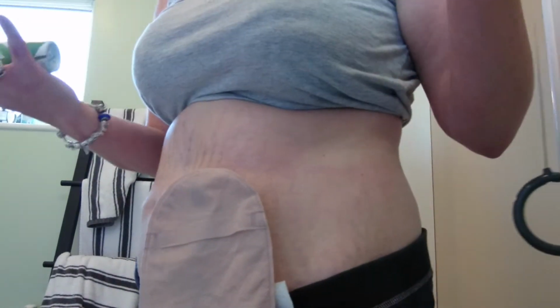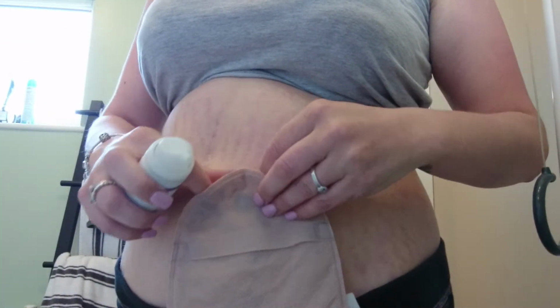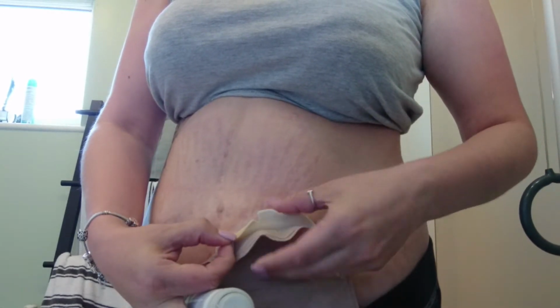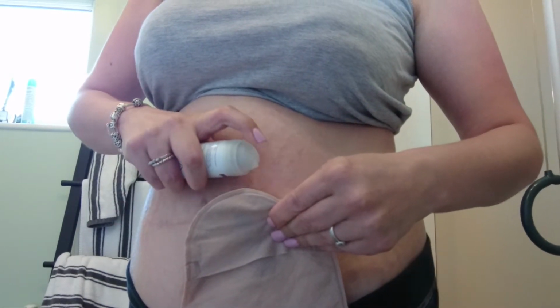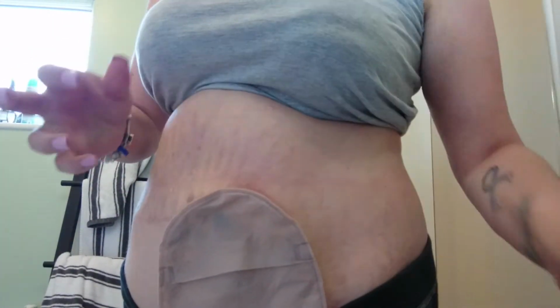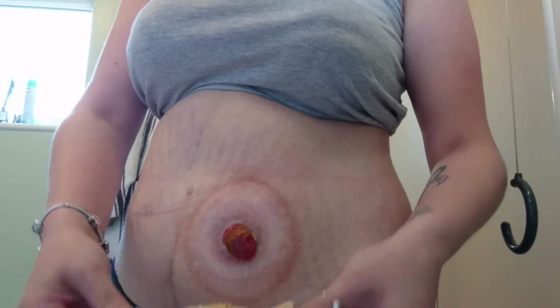So just had a shower, wet ostomy bag, and I've got my adhesive remover. And the trick is if you peel down a little bit, I'm quite lucky, mine's quite a soft convex, so it doesn't stay stuck very often. So if you just peel down a little bit, and it's literally 2 sprays. So if you do one side, as you see, that's starting to slide off. And if you do 2 on the other side, and that is literally it. So if I pull that down, that's all off. I'll just put that in the bin.